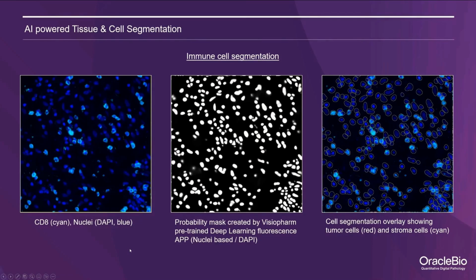However, in some instances, you may find that you don't detect all the immune cells that you want to because they don't have a clear DAPI stain nucleus present. So therefore, you can add the CD8 channel to the neural network training channels and then include annotations of CD8 stained cells in the training markups, further train the app, and this will improve the CD8 detection performance.